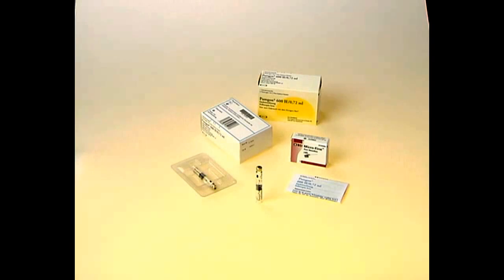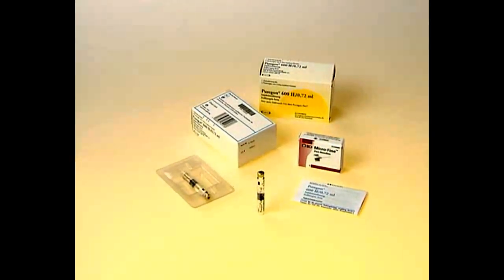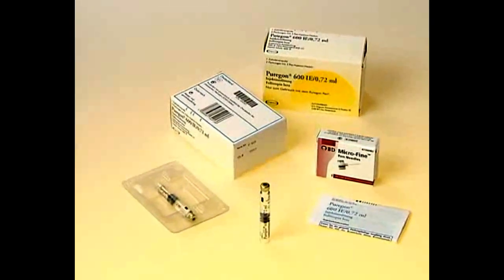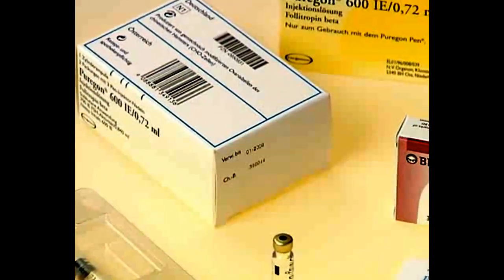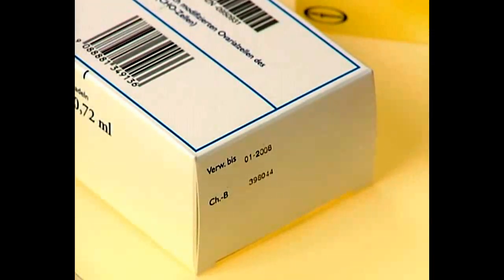If you decide to keep your Purigone cartridges outside the refrigerator, please remember that you can only store unused cartridges for up to three months at temperatures up to a maximum of 25 degrees Celsius, or until the expiry date printed on the cartridge carton, whichever occurs first.